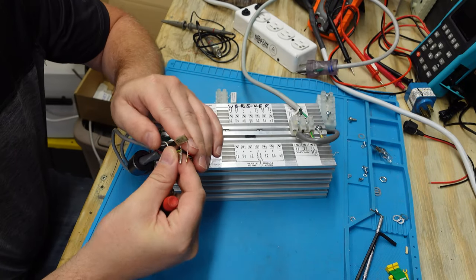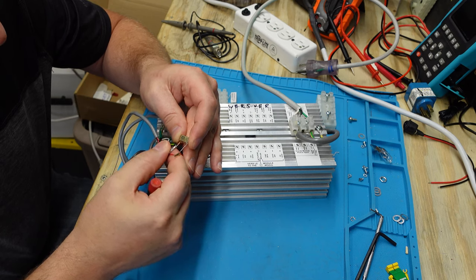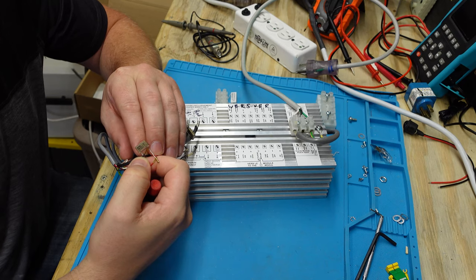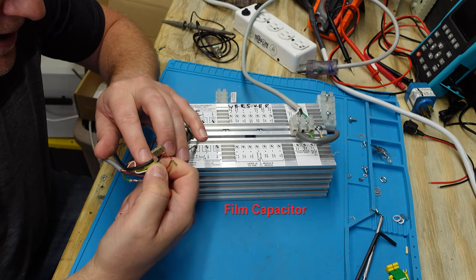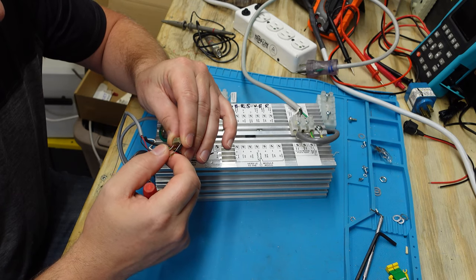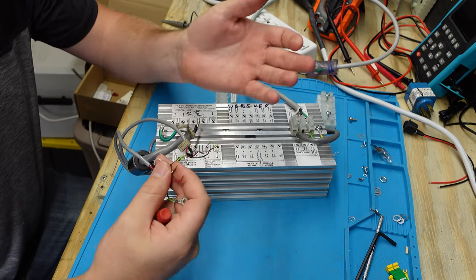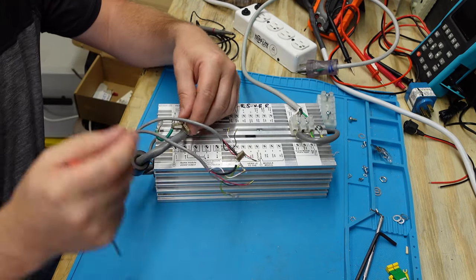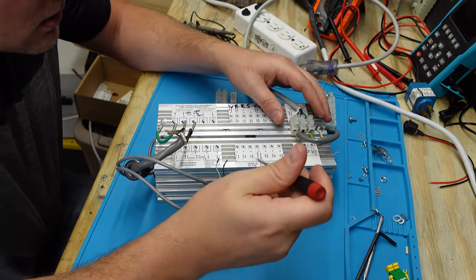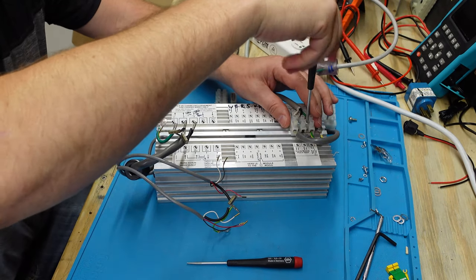One of the components I didn't really understand what it is. I'll have to look it up later. Is this little guy right here? I would assume that this is a little like coupling capacitor. It says 1N5Y2. It's a RIFA, R-I-F-A, PME271. I honestly have no clue what that guy is. And I've got a couple others right here on this one. Let's see, this is AC mains.